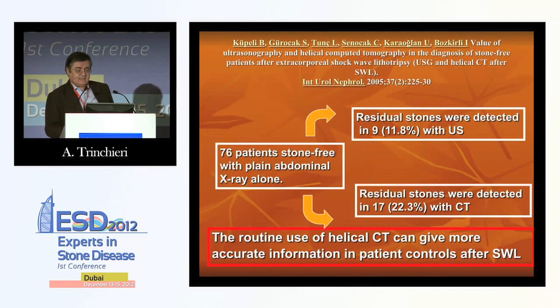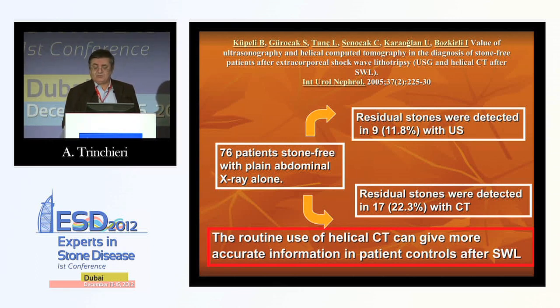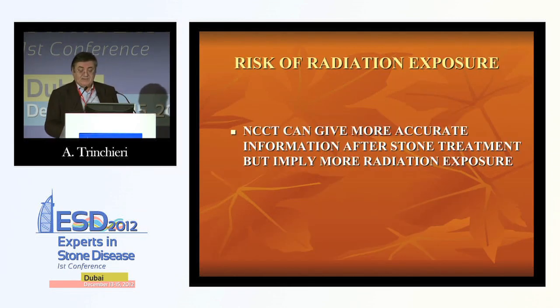And in this study, it was demonstrated that patients that were judged stone-free by plain X-ray alone, in about 10% of the cases had stones at the ultrasound, and in 20% of the cases with CT. So the authors concluded that the routine use of computed tomography can give more information in patient controls after shockwave lithotripsy. But the problem is that you have better information, but this implies a lot of radiation exposure.